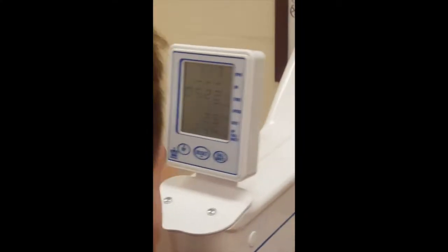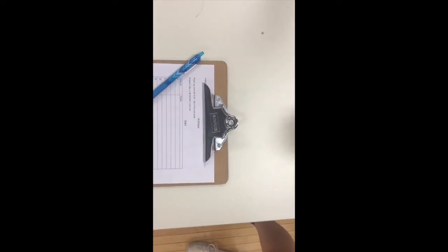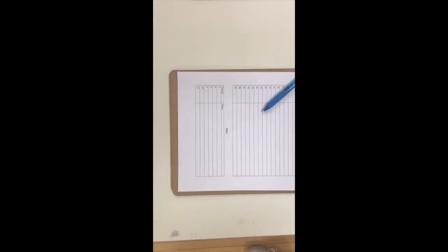A researcher should record the screen so they can refer back to the power. The data collected from the videos can be transferred to a data sheet and done for any number of trials. This concludes the protocol for an upper body Wingate.